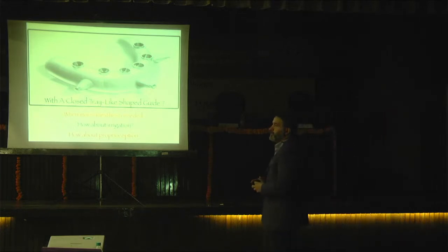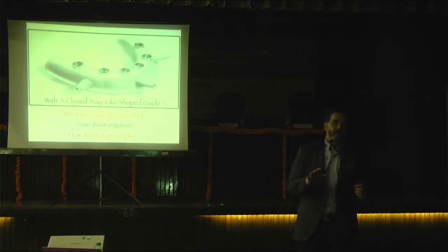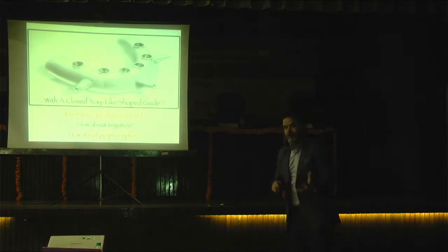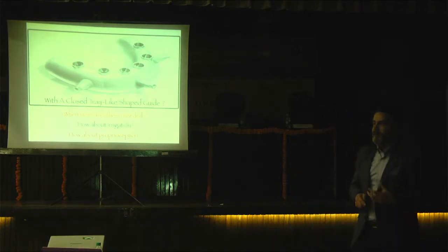And how about the proprioception? Proprioception is a very, very, very important feeling for a dentist when we work. We want to feel the pressure where we are, and with a closed tray-like shaped guide, it's almost impossible to feel this comfort.